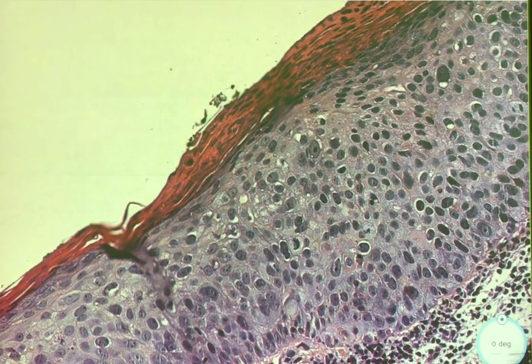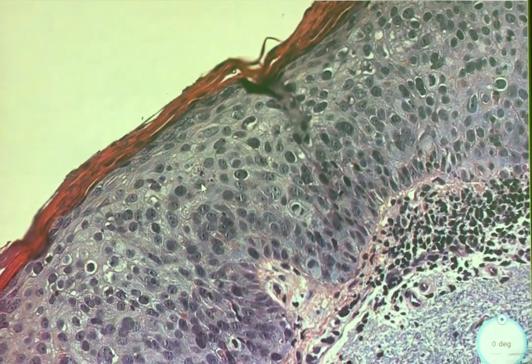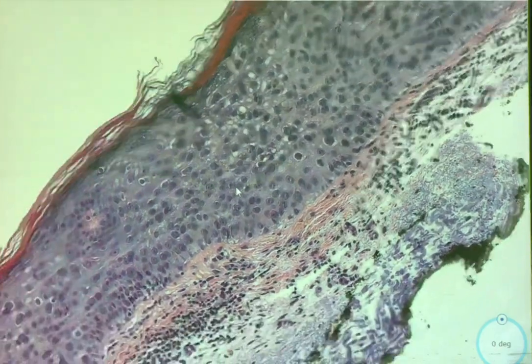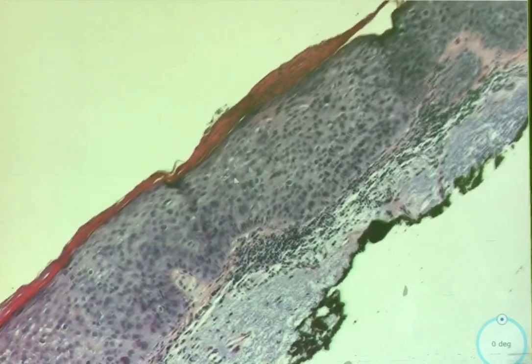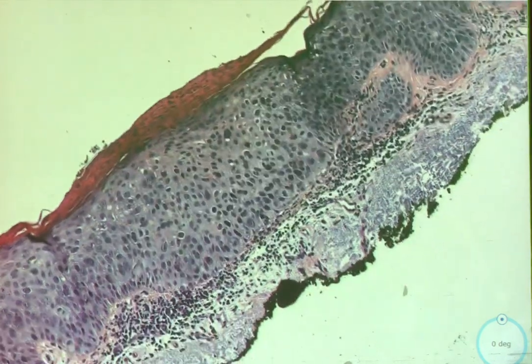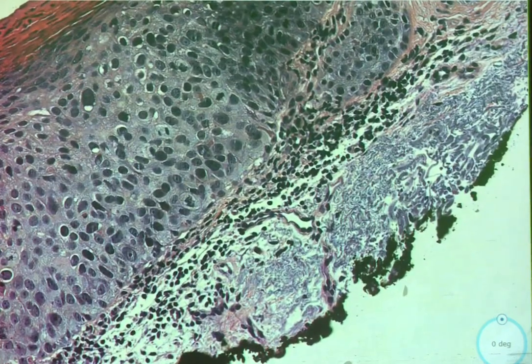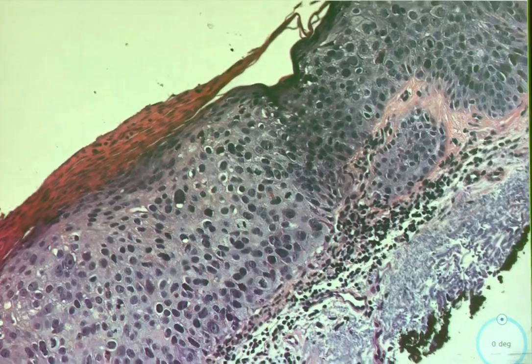So what do you think it is? Are we atypical? Definitely. Alright. Are we cancer? I think this is a cancer. Okay. So now for the hard question. Are we invasive? Yeah, we should look. This is a noteworthy case. You have to write a note. This is not invasive. Okay, but can you be sure it's not invasive based off what you have here?